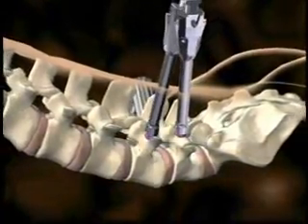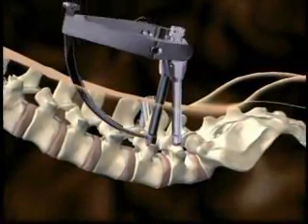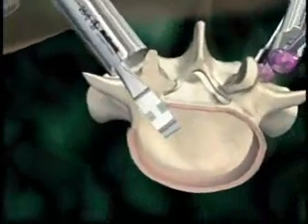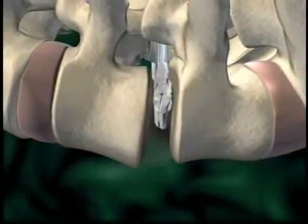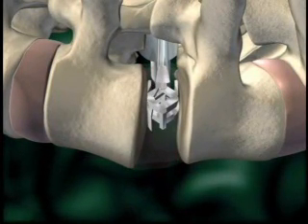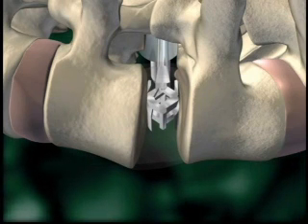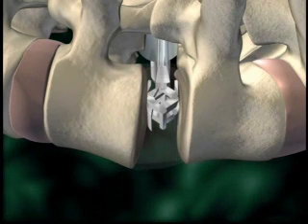The instrumentation is inserted as a means of maintaining distraction achieved from ipsilateral access to the partially prepared disc space. An expandable distractor is introduced at its minimal height of seven millimeters. This distractor may be incrementally expanded to achieve optimum restoration of disc space height, up to a maximum height of 14 millimeters. Contralateral screws are provisionally tightened to maintain distraction. The expandable distractor is then collapsed and removed.